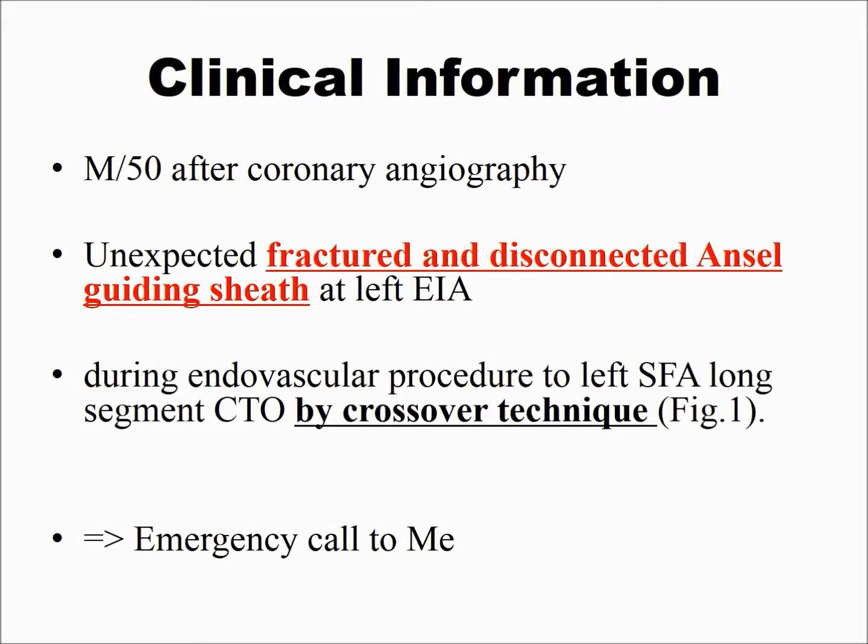I got an emergency call from the angio-cath suite. After coronary angiography, an unexpectedly fractured and disconnected Ansel guiding sheath in the left EIA occurred during an endovascular procedure to the left SFA long segment CTO by crossover technique.